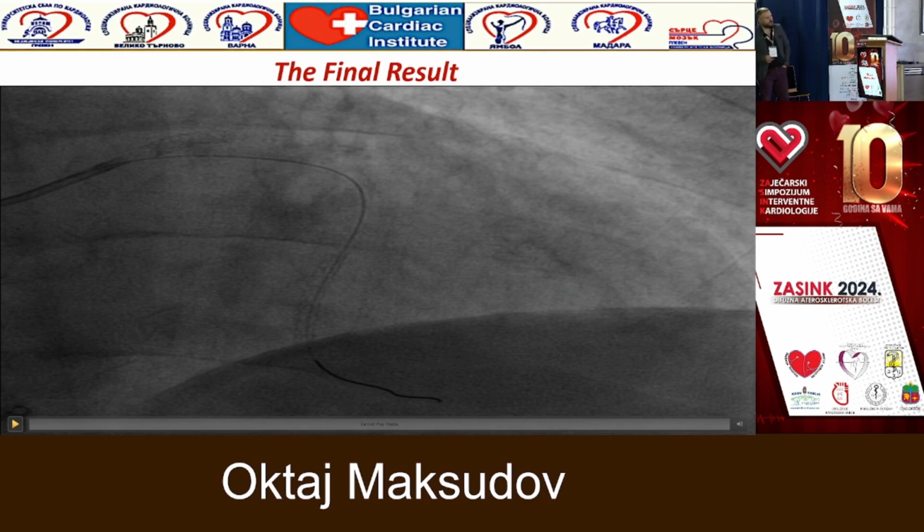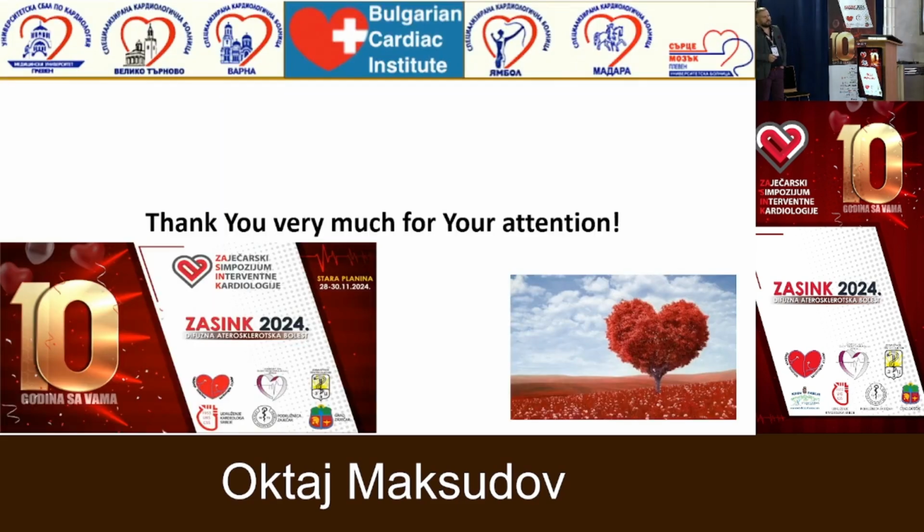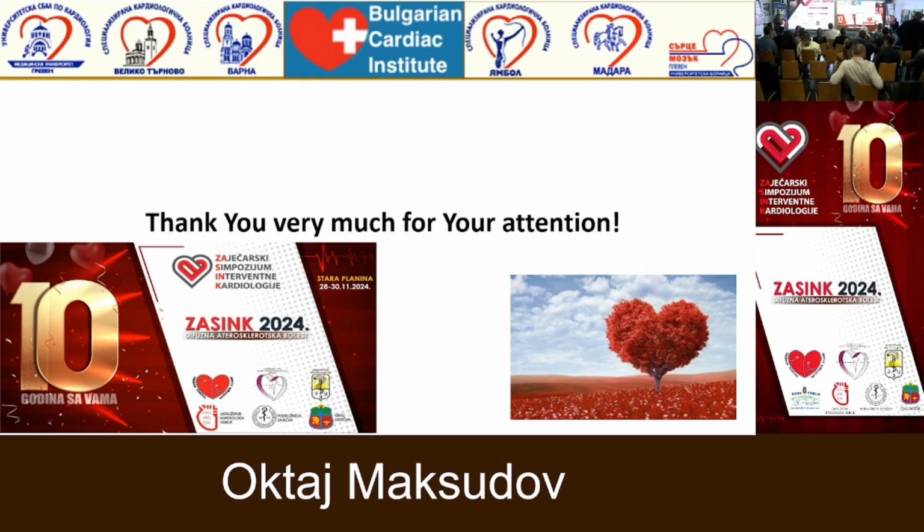So you must believe me, it was an excellent result. This is the arm after the procedure, 100% of saturation, and the patient was discharged 2 days later. So thank you very much for your attention. Thank you for excellent cases.